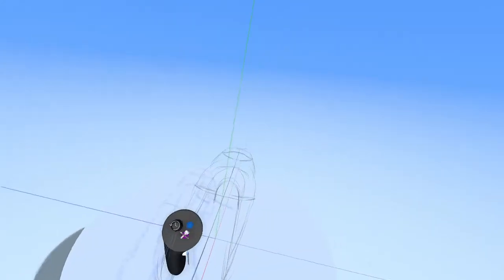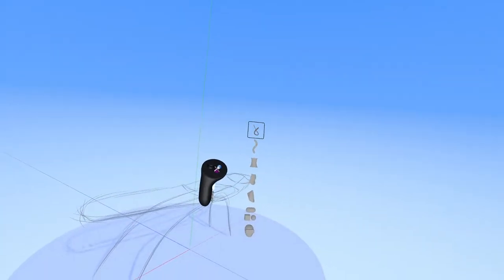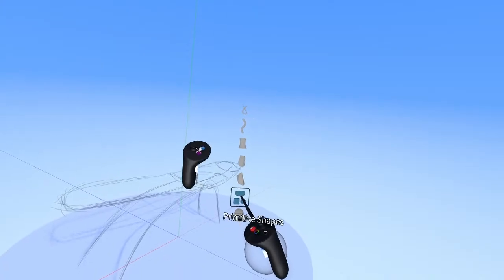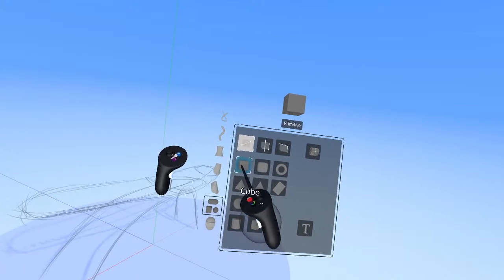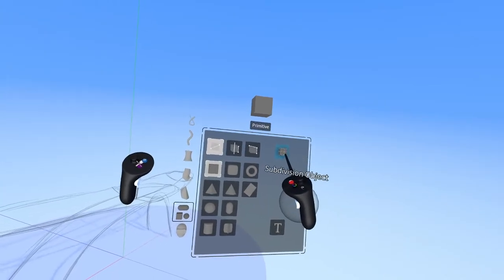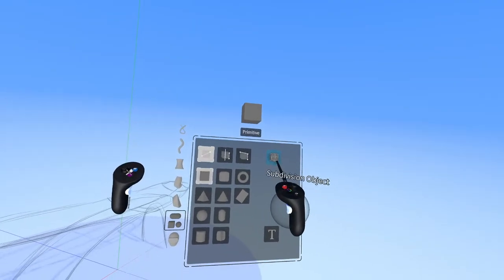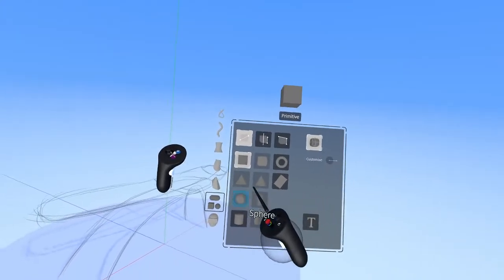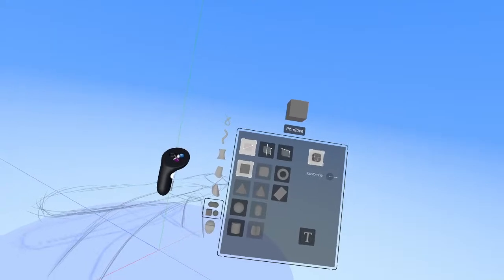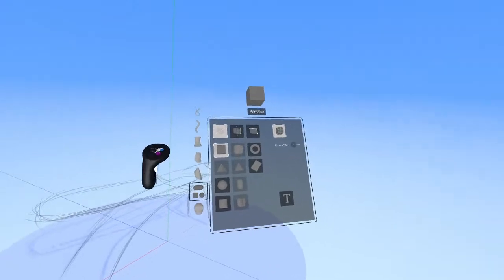So there's all sorts of ways that you can do surfacing in Gravity Sketch, but the simplest way of doing surfacing is to press the purple menu button, go to Primitive Shapes here, click it twice, and you could either start off with a primitive shape like this, or you can start off with a subdivision object. So in this case, we're just going to start with a subdivided object. We're going to click this here, and you'll see it gets rid of all the shapes that you can't use when using Sub-D. And so by default, we have the cube here. That's perfect for what we're working on.